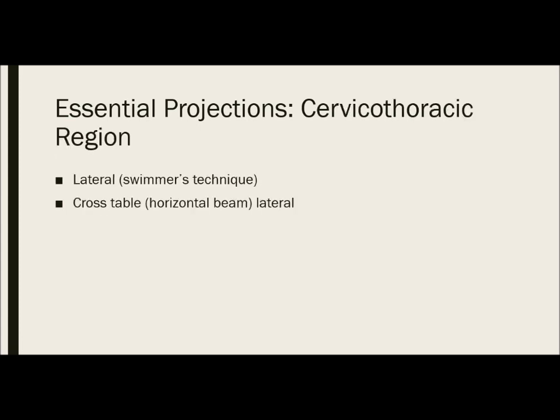And then for the cervicothoracic region, we're going to go over the lateral swimmer's technique and our cross-table horizontal beam for the lateral, in case you wouldn't be able to get it erect or supine.